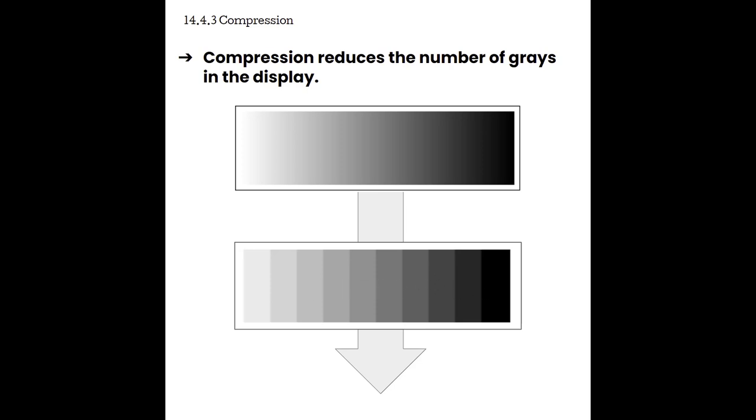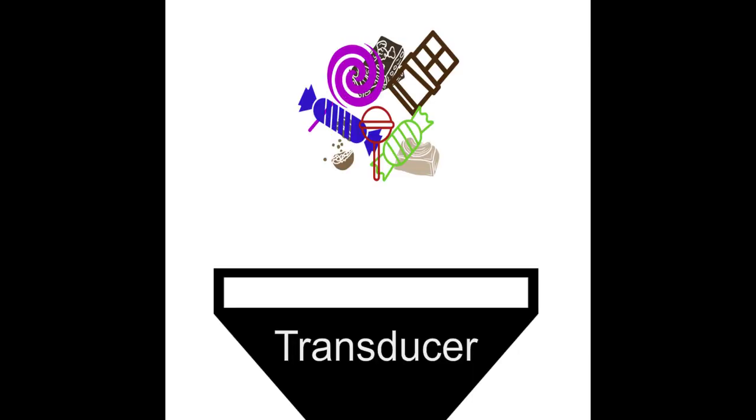So let's take a closer look at what it really means to compress. We've got a hypothetical example: a machine that's capable of sorting candy. One machine might be able to tell the difference between a chocolate bar, chocolate caramel, chocolate nougat caramel and peanuts, and it can also tell the difference between fruity candies, the ones that are chewy or crunchy, sour and sweet, sucker, non-sucker, whatever. This super detailed machine is kind of like your transducer. It's really good at parsing out all the detailed information about the echoes returning from your body.